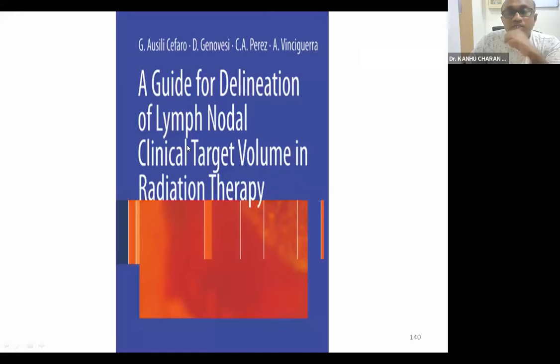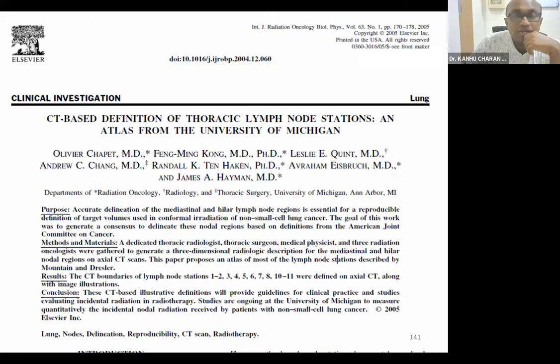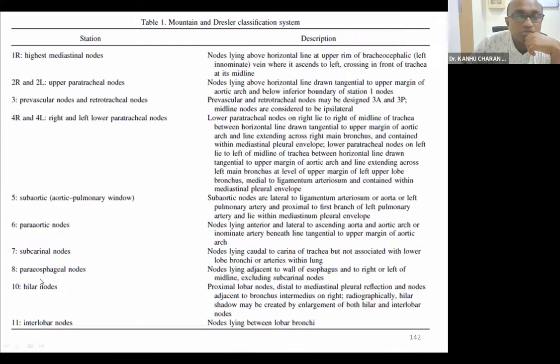Lymph node delineation, you can follow this guideline, and many atlases are available. There are 14 groups of lymph nodes.